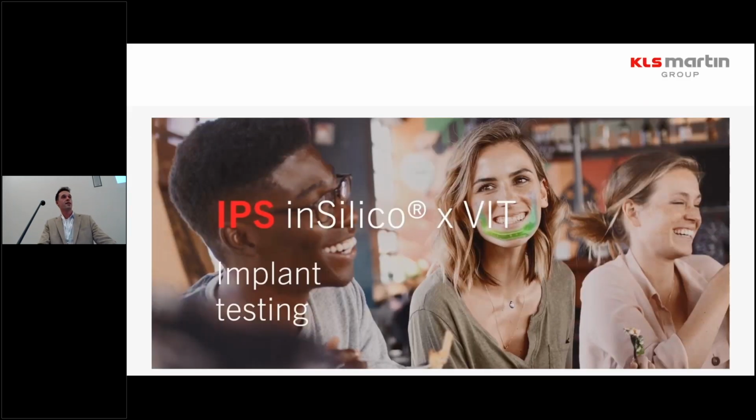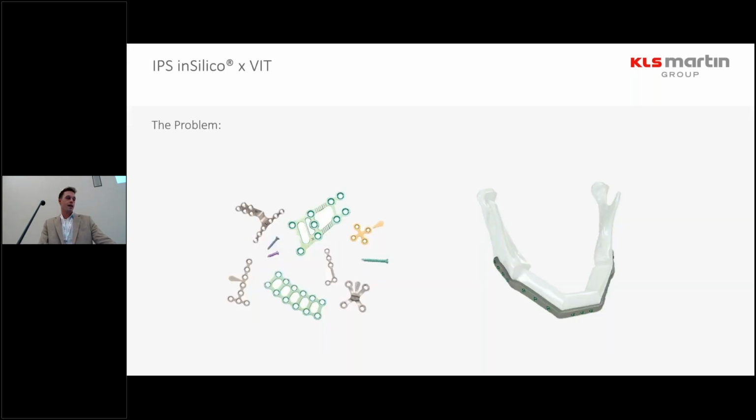Secondly, the VIT software, so the software for virtual implant testing. Here, the problem we were facing in the beginning was that when you compare our standard implants with our patient-specific implants, there's a big difference in testing those implants. So if we develop a new standard implant, we can do mechanical tests on them. We can do mechanical tests on hundreds of implants to really make sure that they are documented, they are standardized, they are approved to make sure they can withstand the forces we are calculating with.